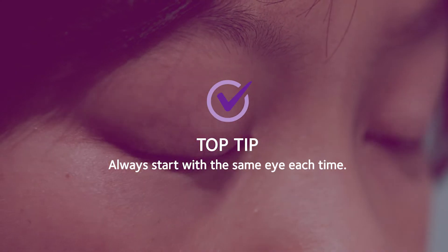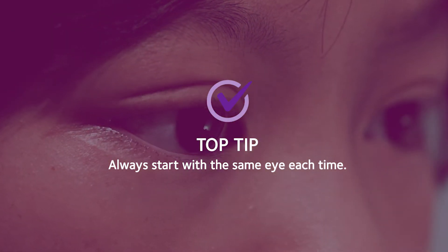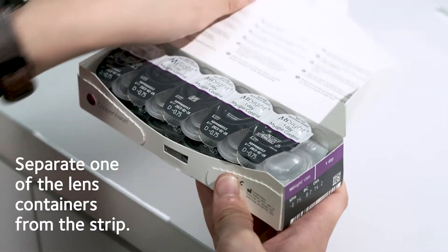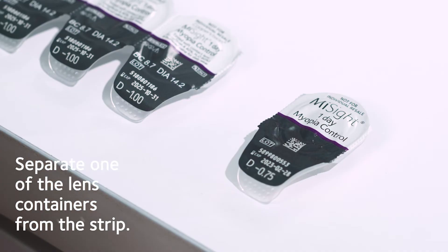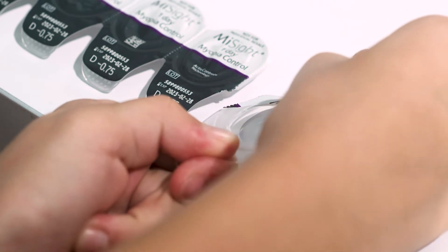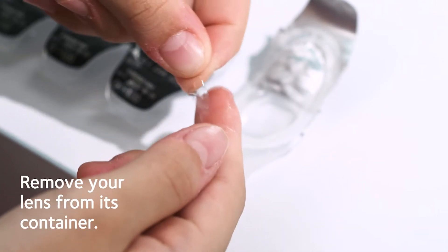It's a good idea to make it a habit to start with the same eye each time, so let's start with your right eye. Separate one of the lens containers from the strip, peel back the foil, and remove your lens from its container.